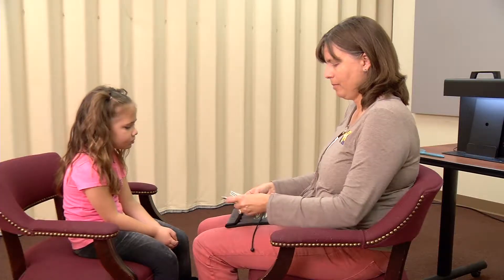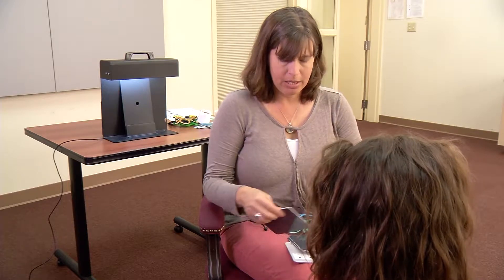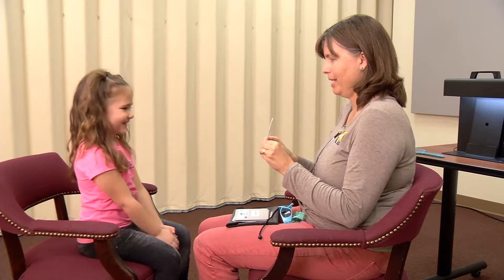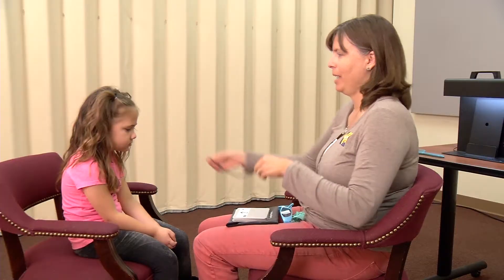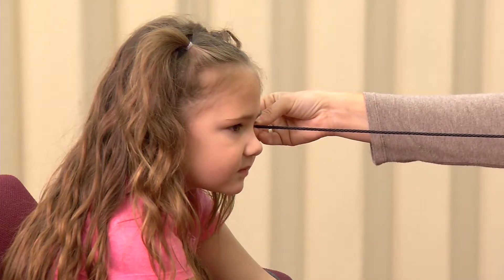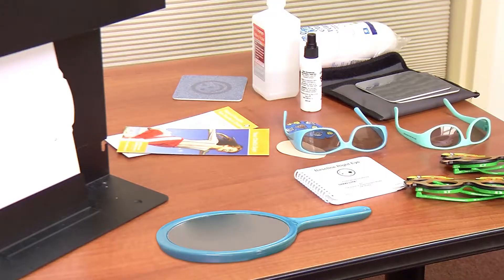Conduct the PASS 2 test in the same area that you set up for tests of recognition visual acuity. The room should be a well-lit, glare-free area to ensure that no reflections or extraneous glare can be seen on the cards. Arrange the seat for the child so that the cards can be held comfortably 16 inches from their eyes. Check the distance with the measuring cord provided with the test. Set all sizes of the pediatric polarized viewers, cards A through C, the blank card, and an alcohol prep pad on a table near the seat for the child.